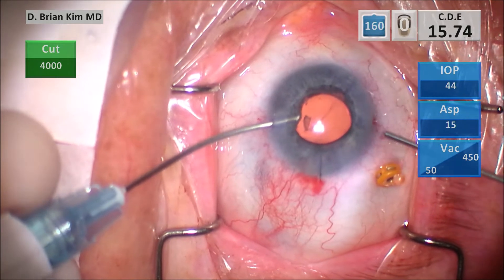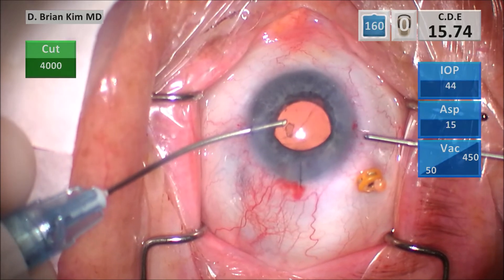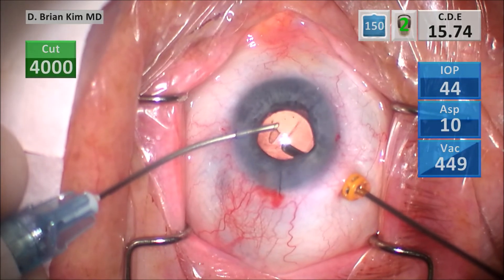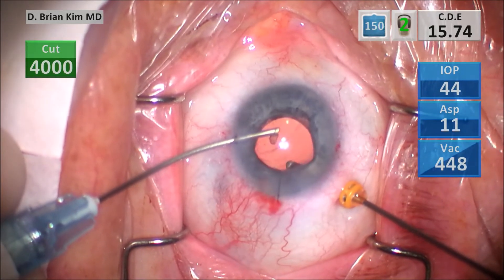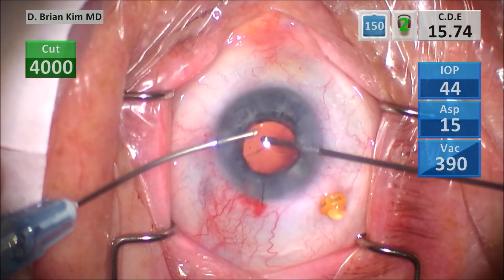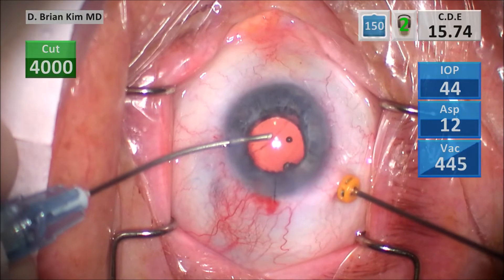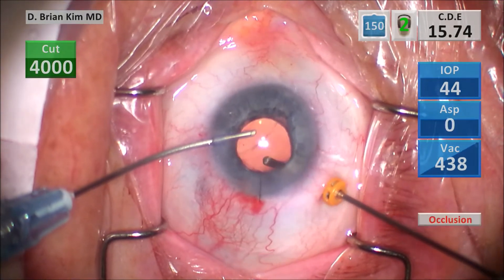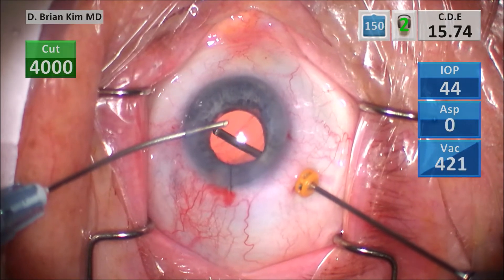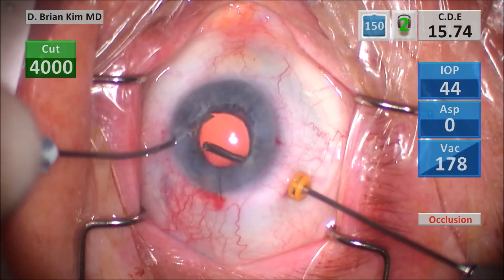I'm going through my left paracentesis incision — I debated whether to go through the front or the back. What I decided was to go through the pars plana first. By doing that, look at the deepening of the chamber — I did just a little vitrectomy and it deepened the chamber really nicely. Once I did that I was able to go anterior. There was a small fragment there — I gobbled that piece up, removed the vitreous attached to the left side incision, then went back through the trocar. You can see as I'm doing the vitrectomy I'm making sure I'm not eating the posterior capsule, staying right over the defect only, because that's where the vitreous is coming from.